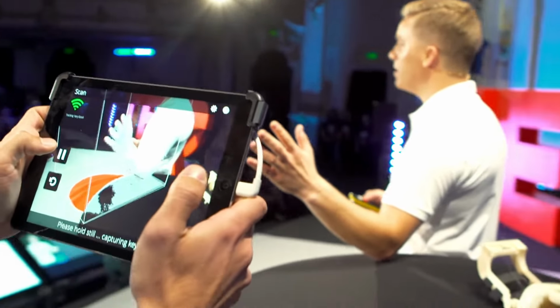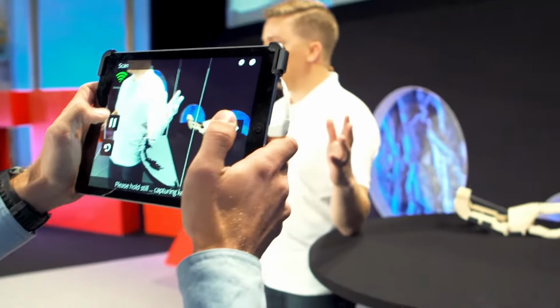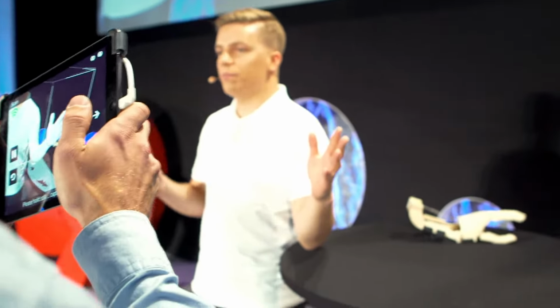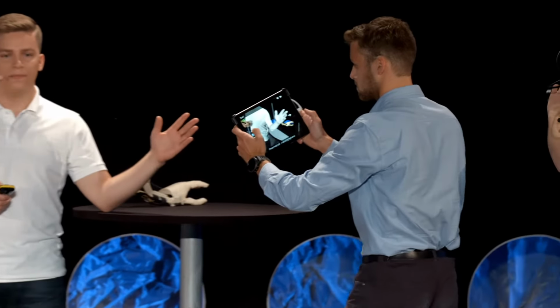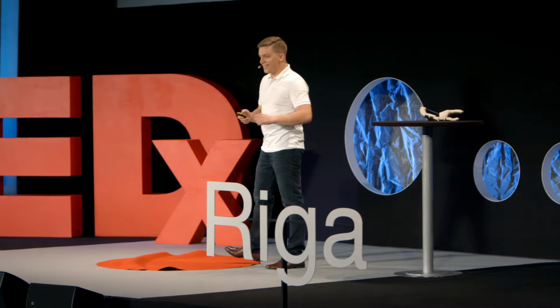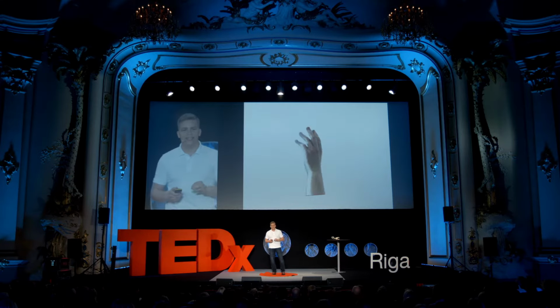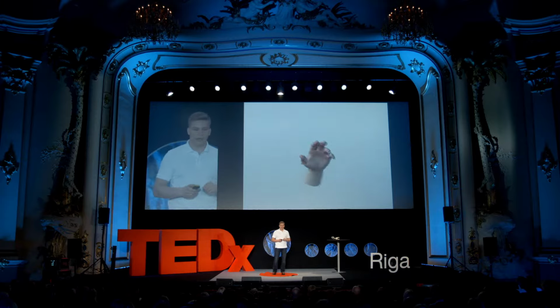He's using an iPad with a small add-on. The small 3D scanner works by projecting an infrared laser pattern onto my hand. It cannot be seen with the naked eye, but the iPad's camera can pick it up and make it into a 3D model. Thank you, Fritzi. Let's take a look. In just about 60 seconds, we have a 3D scan of my hand.